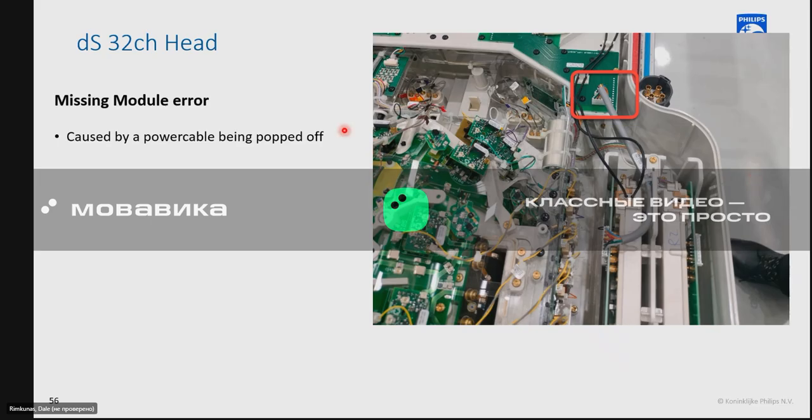Here's another example of why opening the coil, even without specific instructions or knowledge about what to look for, can help. This coil had a missing module error. They popped it off, and they could see right here that this connector had popped off. This is a power distribution board. It feeds 2 RXCs here. These RXCs did not have any voltage, so the system wasn't seeing it. We were having communication errors. Pop that back in. We've got good voltages going to the RXC, so they're powered up. The thing worked.